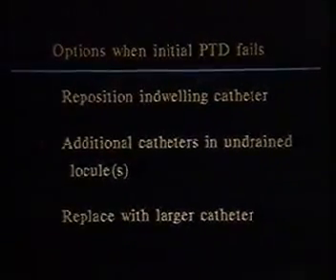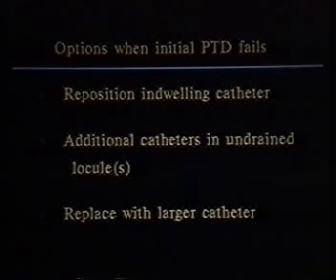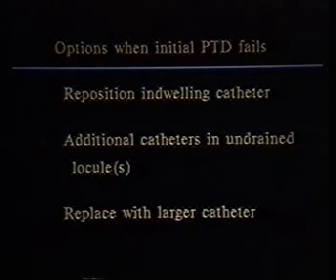What do you do when your procedure has failed? It's known in the surgical literature that tube thoracostomy with very large bore tubes clearly fails at least 25 or 30% of the time. So it's not an uncommon situation that we would expect our smaller catheters to fail as well. And I think it's important to realize what factors you need to look at to determine whether your failure is due to factors that you may be able to control versus those which you really can't control.